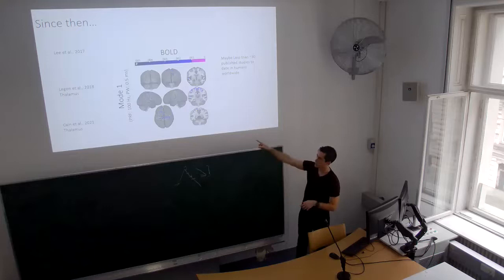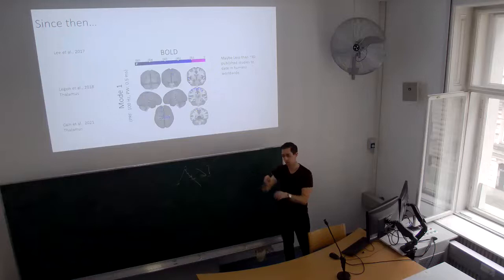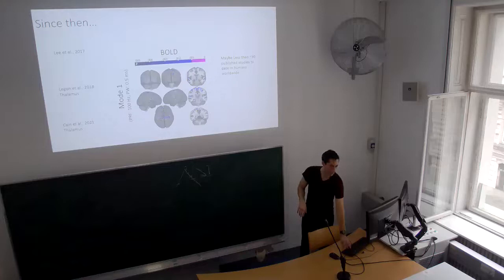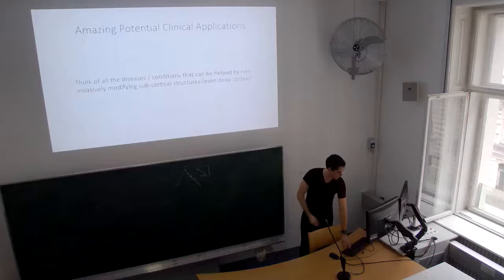What this reflects is the difference in whole-brain BOLD signal during 30-second ultrasound blocks compared to off blocks. So it was on, off, for 10 minutes in the scanner. We recorded the TRs manually in this one, and this is what came out. There are a lot more details, of course, but I'm just moving through it. I should say this reflects inhibition, a reduced BOLD signal during the ultrasound. It's a 5% duty cycle, in line with that whole low duty cycle inhibition thing.